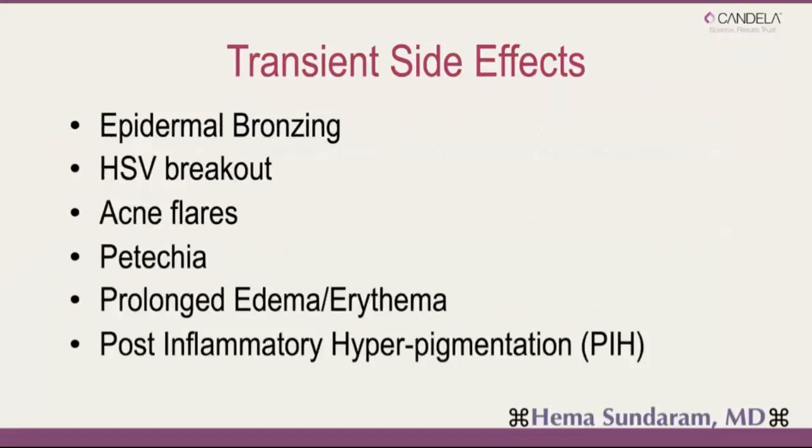I'm going to draw your attention here to this herpes simplex breakout. Of course, with laser resurfacing, we would aim to prophylax with antiviral treatment any patients who have a history of cold sores. But if it happens that they develop one unexpectedly after treatment, it's not a problem. We just need to treat it.